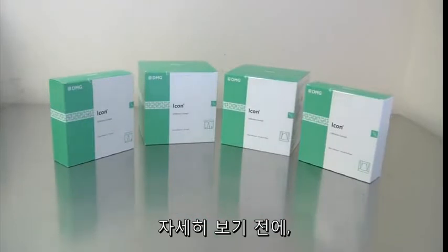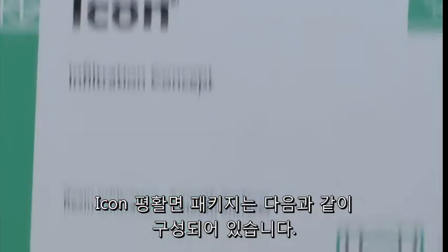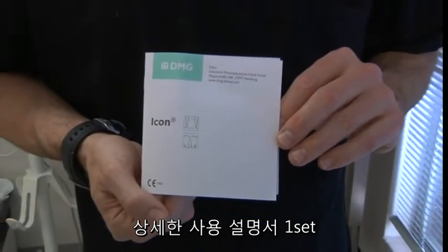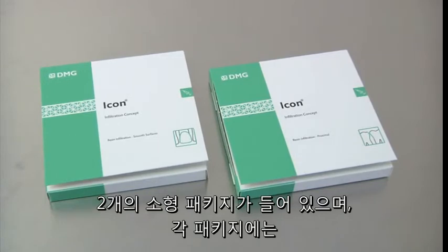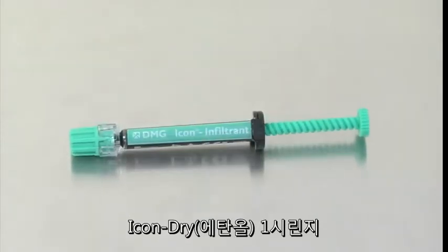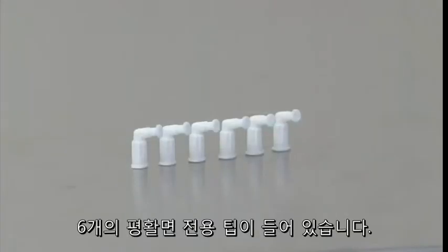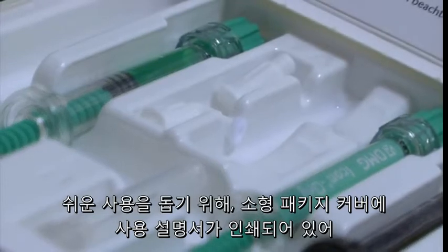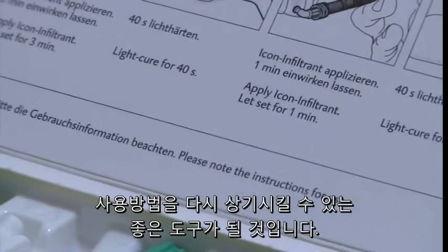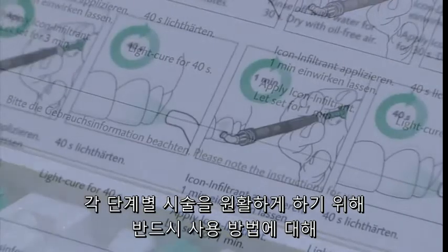Before we proceed further, let's review the components of the ICON Smooth Surface Kit. The ICON Smooth Surface Mini Kit contains the following: a complete set of instructions for use, and two patient packs — each including one syringe of ICON Etch, one syringe of ICON Dry, one syringe of ICON Infiltrant, and six smooth surface tips. A second set of basic instructions for use is printed just beneath the cover of the kit for easy reference. These are good as a refresher after you are familiar with the procedure.